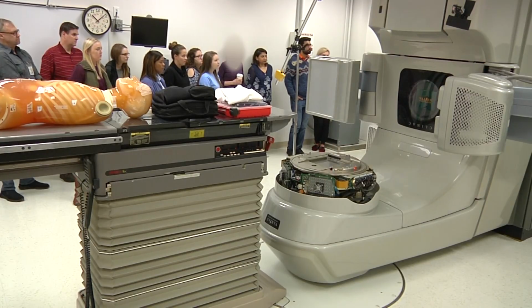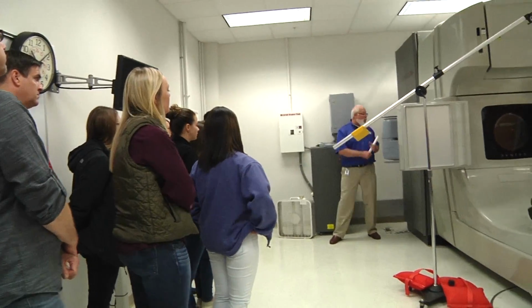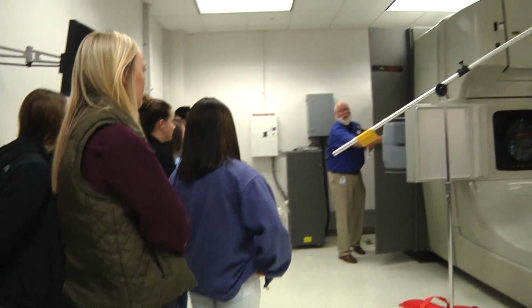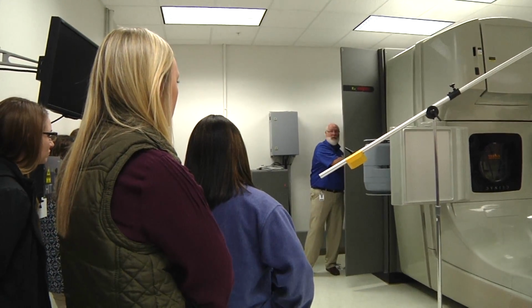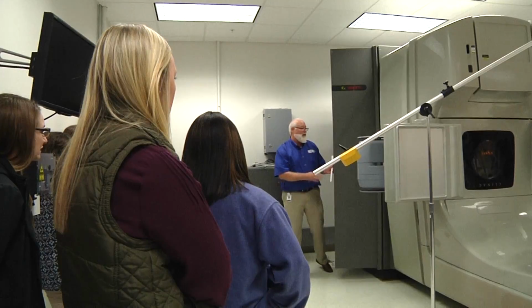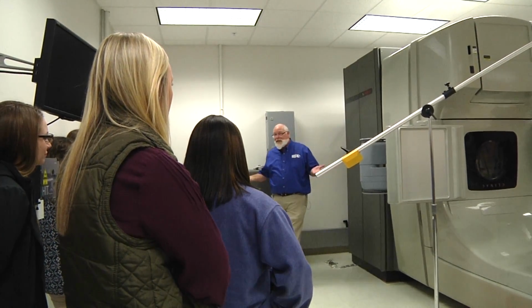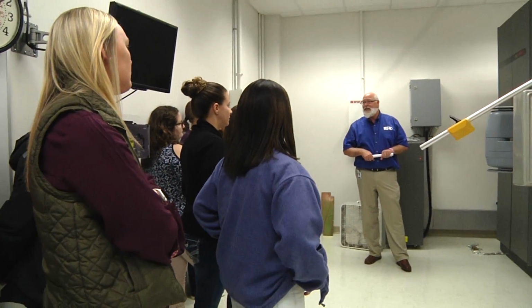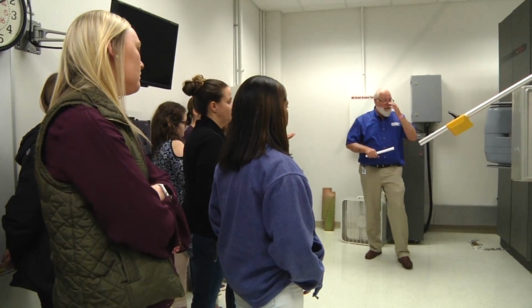Okay, we talked about your emergency offs. This style of door, if you close the door too hard, this is just a spring button that activates this one. So if you slam the door, it's a little flexible, you'll shut the machine down. Which isn't a big thing, but it puts you back 15 minutes to go through standby and warm up and all that.